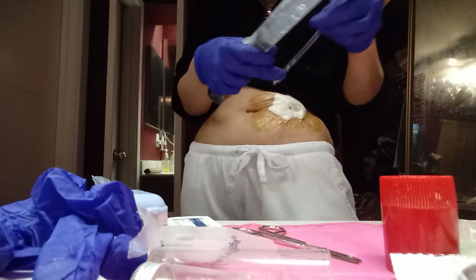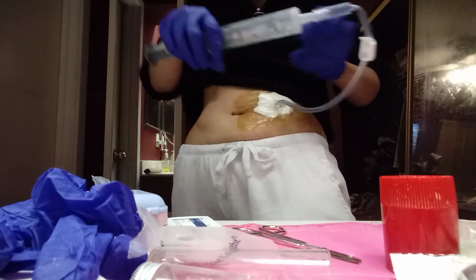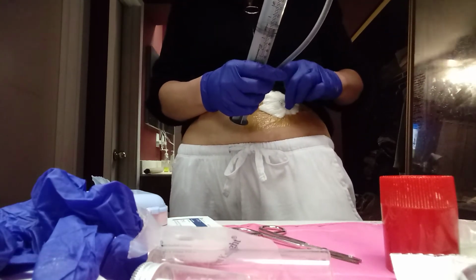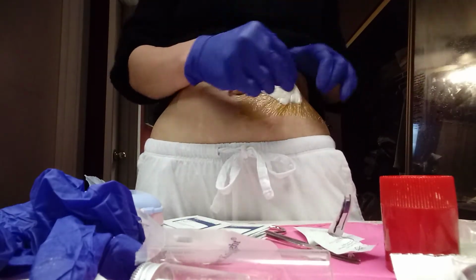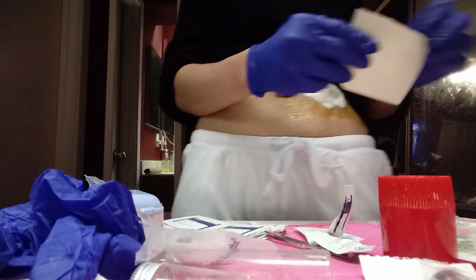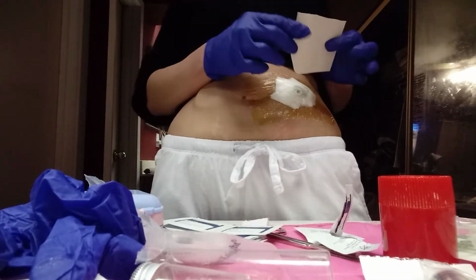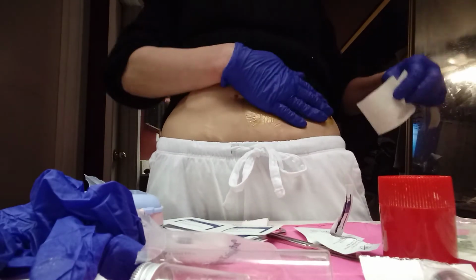this is just a trick on how to use your feeding tube while it's dressed without having to change the dressing every time. Okay, so then I access it, right? Okay, I'm just flushing water. Okay, then what you do, take it off, clean it with alcohol. And then what I did is I cut the normal Tegaderm into 4 halves. Okay? This size. Take it out. Make sure that you're covering the area it's going to cover with alcohol. Okay? I use betadine, that's why it's this color. Cover it up. Okay? Cover it up. That's it. All right? You don't have to change your dressing every time.